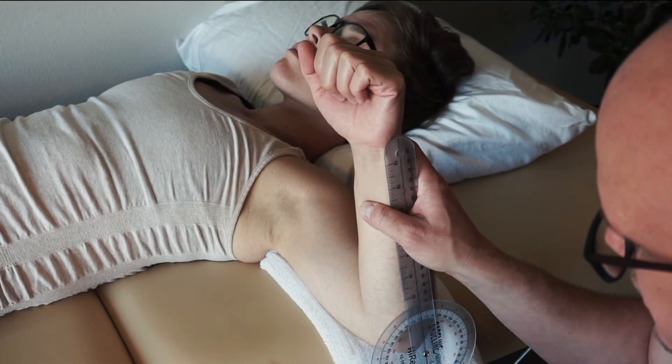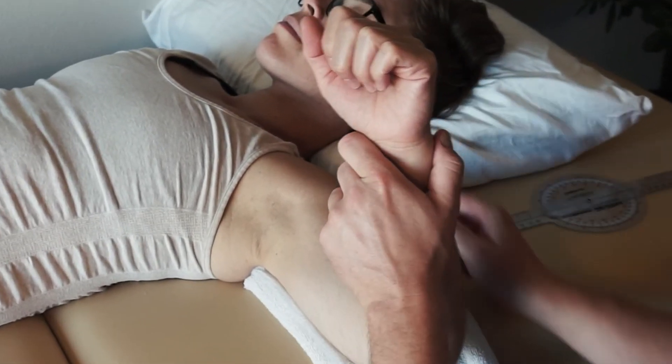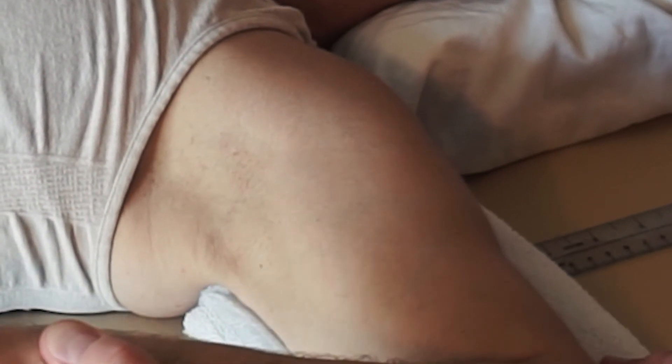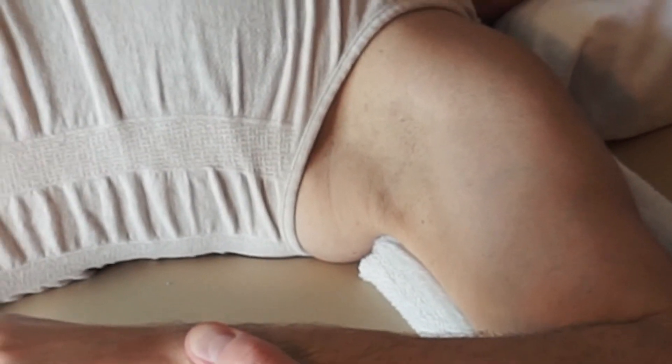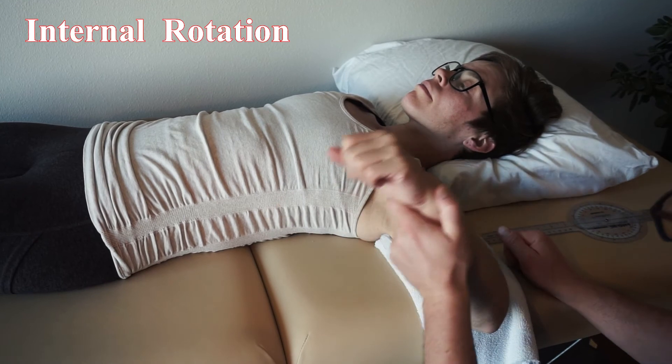Landmarks are all the same. Now we're going to do internal rotation. With this one, watch the shoulder — after a while it starts to come up. That scapula is moving and we have a shoulder girdle movement occurring. So once that happens, that's when the measurement needs to stop.